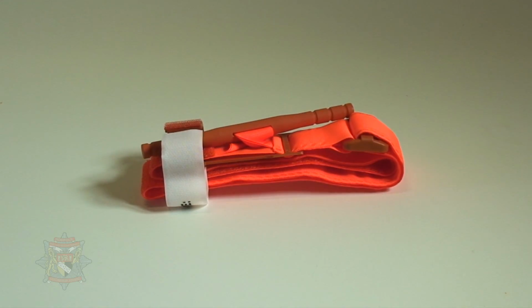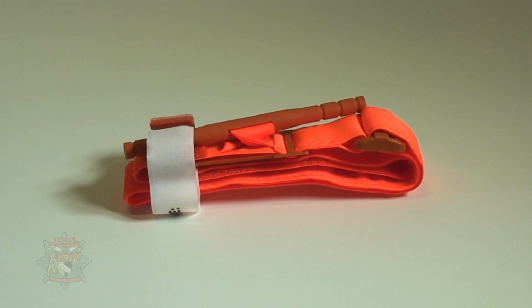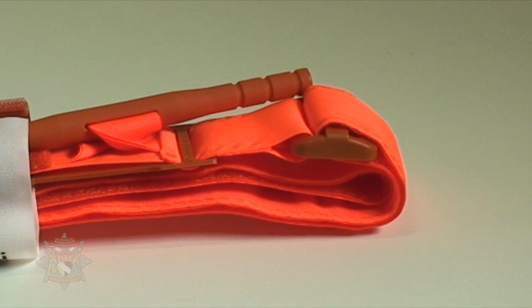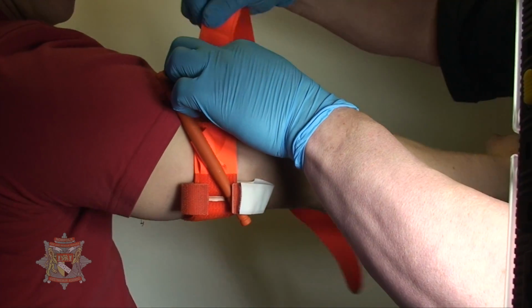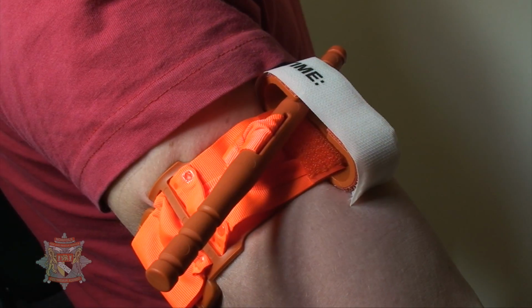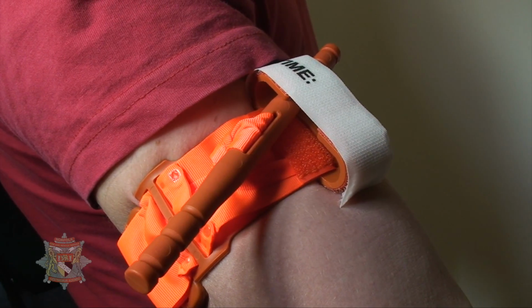Originally developed for military applications, the CAT, or Combat Application Tourniquet, is a small, lightweight device used to completely occlude arterial blood flow by applying circumferential pressure to an extremity. Once applied, the tourniquet can be locked into place to help stabilize the casualty pending further medical treatment.